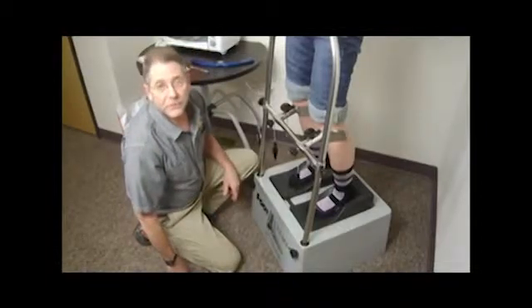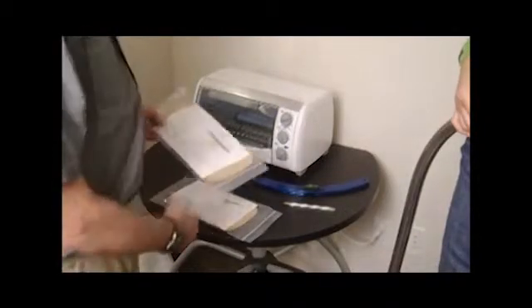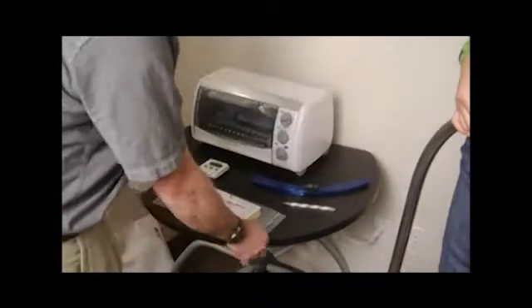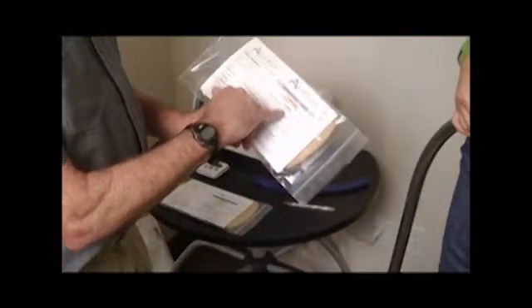Now we're going to heat the cores and take the foot impression. So the impression cores come in two sizes. Large, which is women's 9.5 or larger, or men's 8.5 or larger. And medium, which is women's up to size 9.5 or men's size 8.5. Since Cindy's shoe size is approximately a woman's size 8, we're going to go with the medium core.